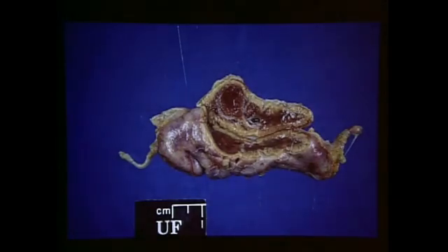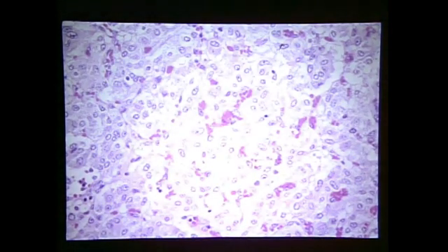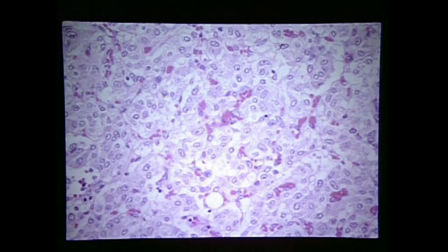And then the second site is the medulla. Pheochromocytomas may very rarely be diagnosed in the horse's adrenal as well. This is not very impressive, but nonetheless it was a small pheochromocytoma. This one is a better example in that it has somewhat grown into the cortex and certainly has enlarged the adrenal. Pheochromocytoma. The makeup is sort of an organized compartmental arrangement of adrenal medulla cells.